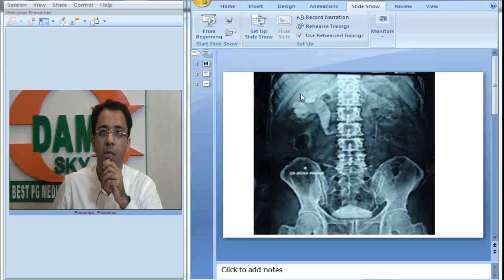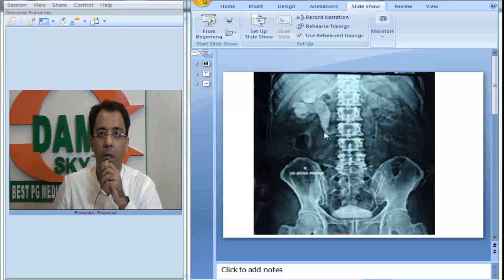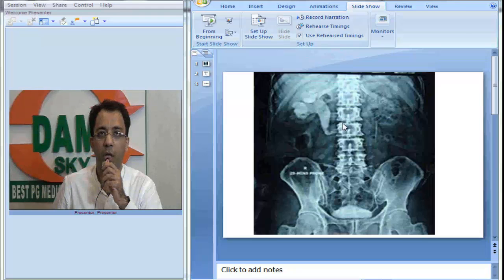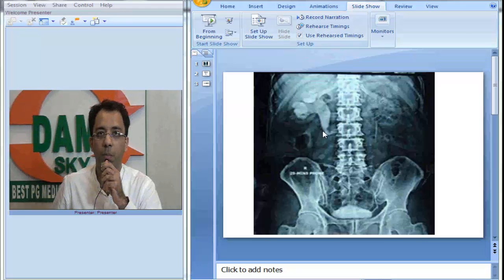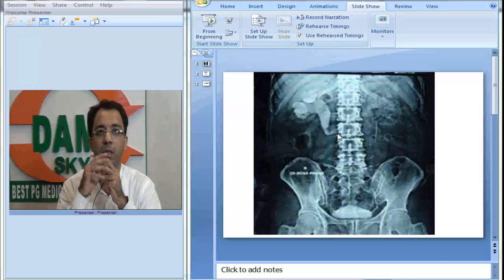You can see there is right-sided hydronephrosis, dilatation of the proximal ureter, and at the level of around L1, L2, L3 you see there is medial deviation of the ureter. What do you think is the diagnosis?